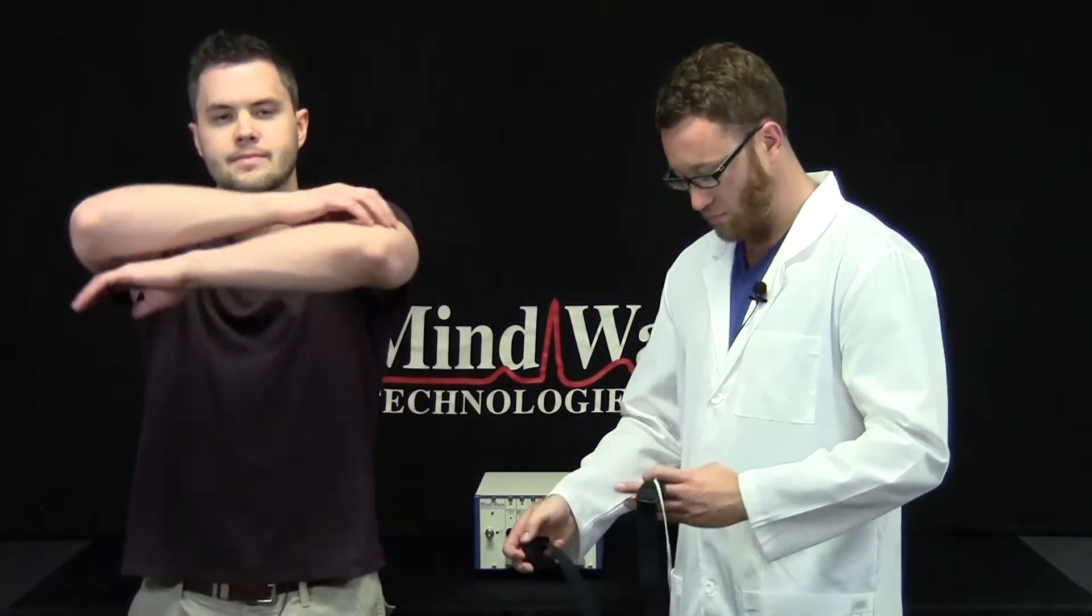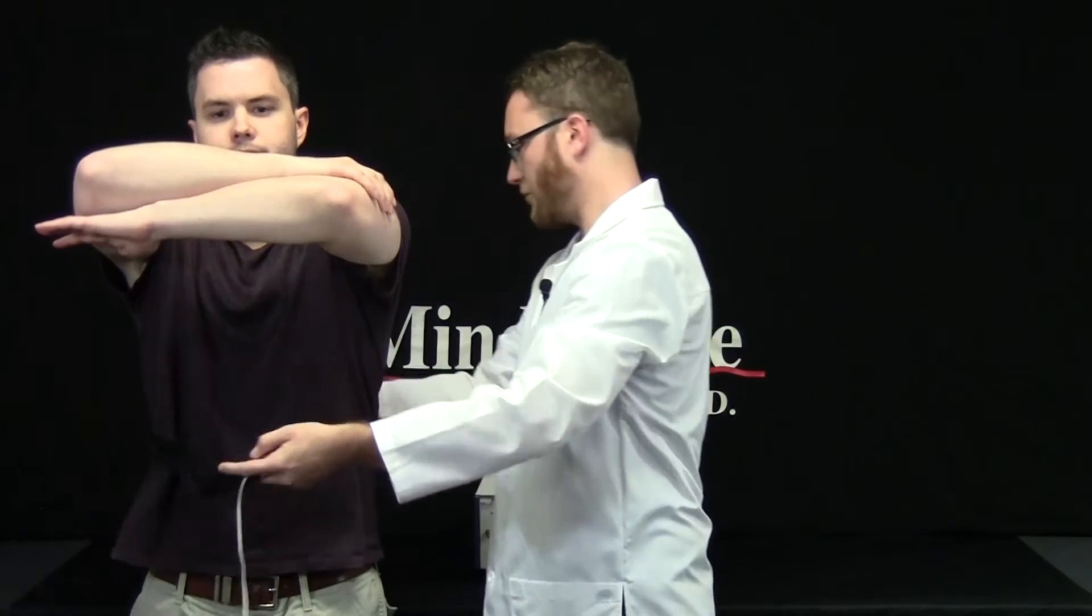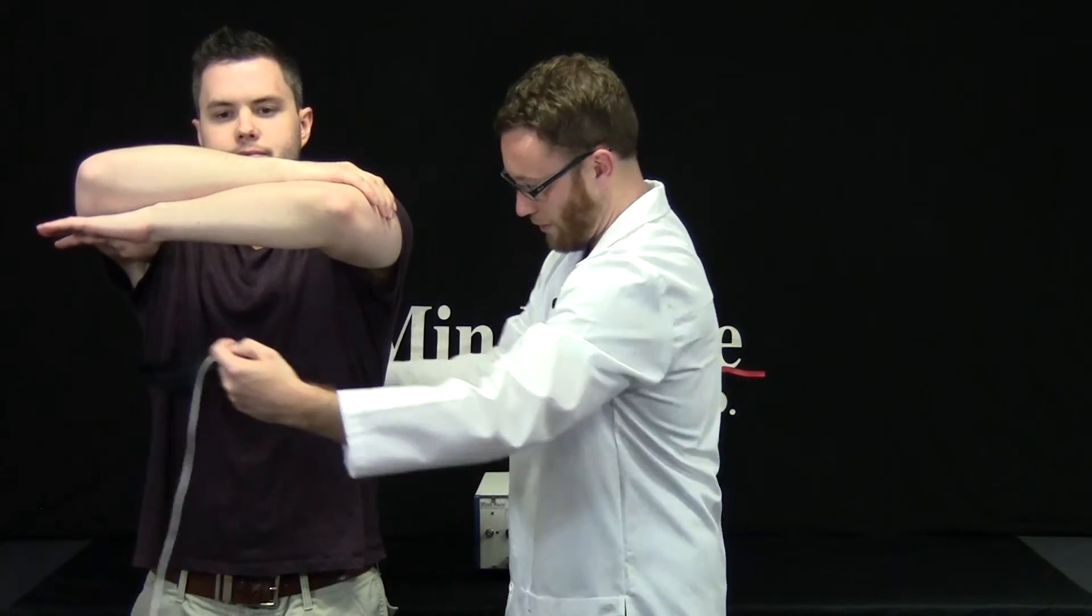Once you've determined the position of the rest belt, ask your subject to raise their arms and wrap the respiration belt around their torso.